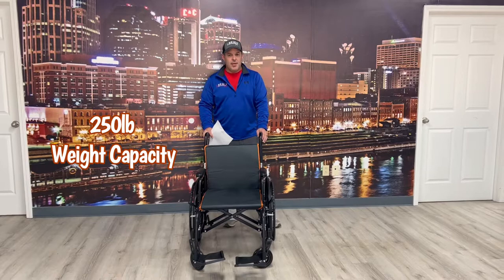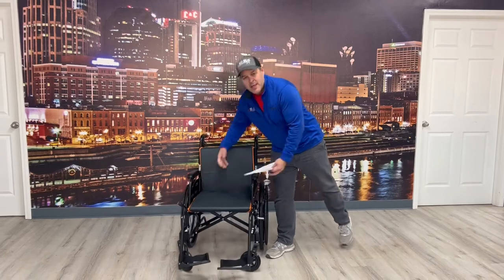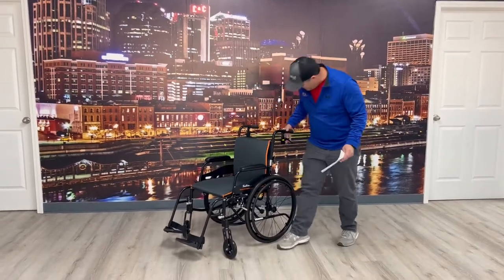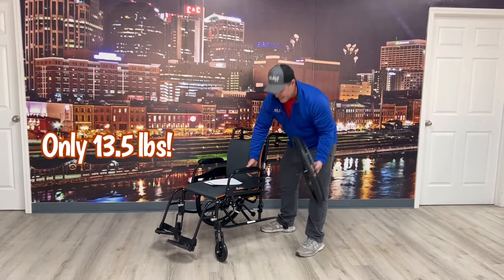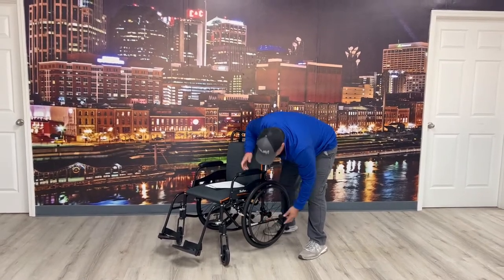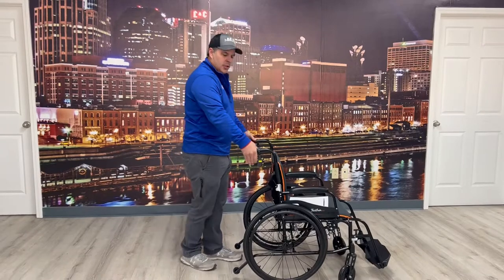This chair has a weight capacity of 215 pounds and it only weighs nineteen and a half pounds, so it's very lightweight. It gets even lighter because it comes with quick-release wheels — when you take the wheels off it gets down to thirteen and a half pounds, so it's a really nice, extremely lightweight chair.